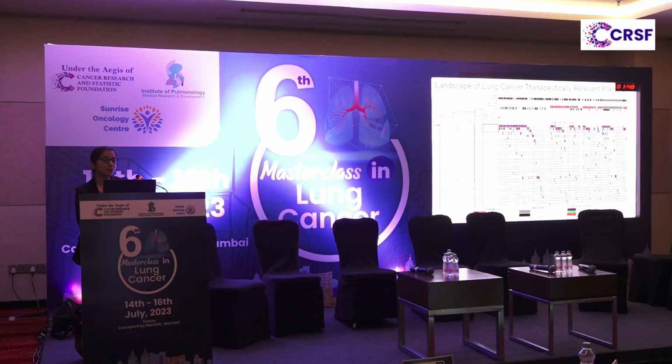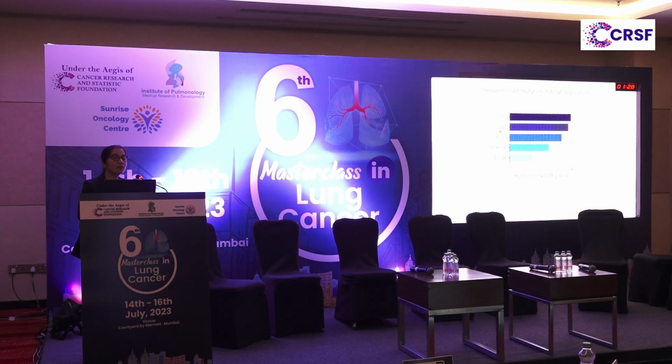the previous reports. Second thing, as madam talked about the genetic alterations, we found that after EGFR, P53 was the most altered gene, and there are various studies which also say that there is a prognostic negative effect of the presence of P53 alteration. Our finding of higher EGFR frequency in this subset of the Indian population is similar to the reports from the Asian studies, where in Korea, Japan, and China, it has been reported from more than 30% to 40%.